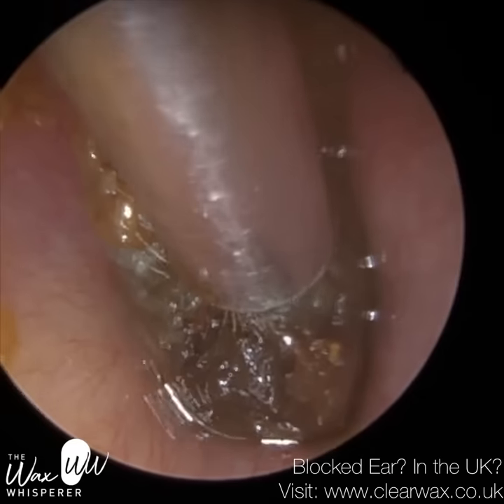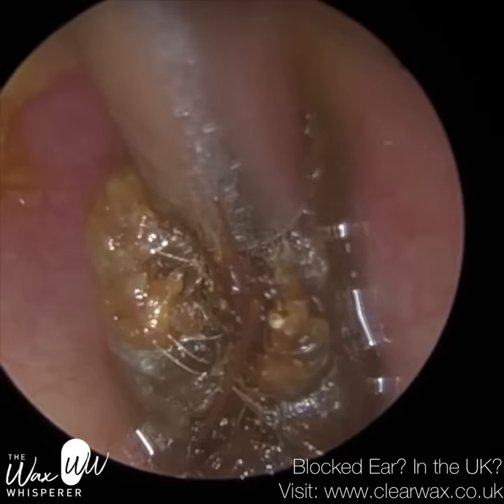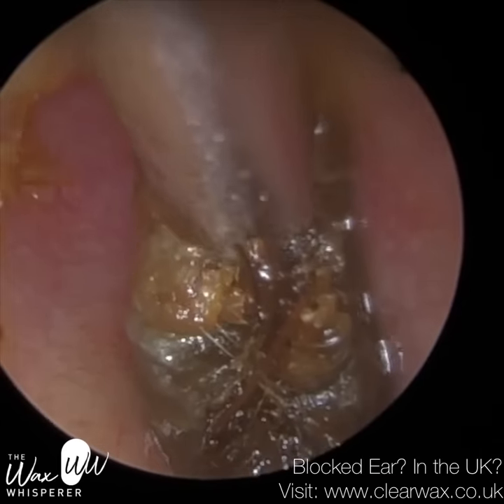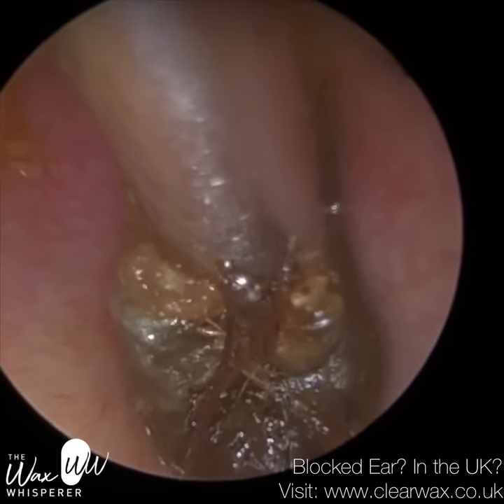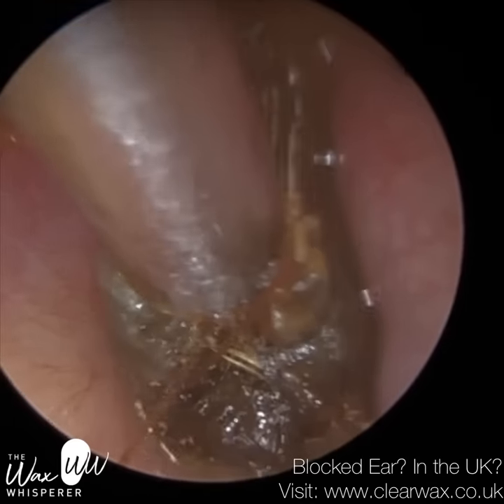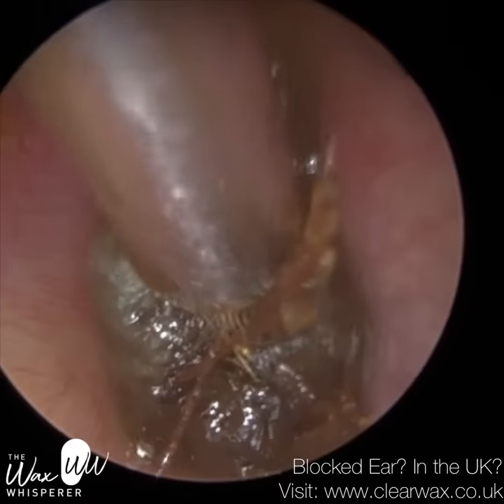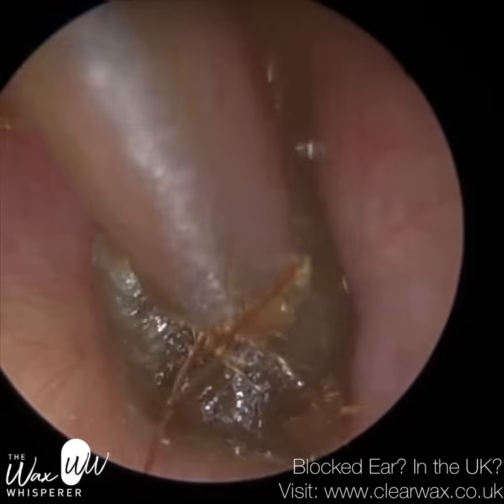It provides you with depth perception. When you obviously touch the earwax, you get that sensation. So I actually feel I get better depth perception with an endoscope as opposed to an ENT microscope. But I suppose also that is in part because I'm using an endoscope all the time and my brain is wired up to use an endoscope. But with an ENT microscope, you just wouldn't get the same view. You'll see a quarter of the ear canal, but it'll be very magnified.